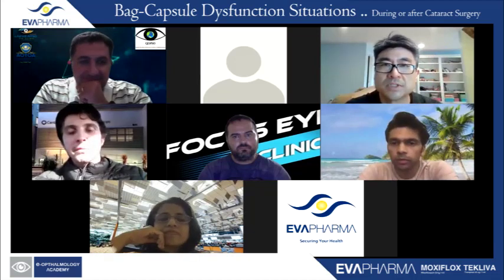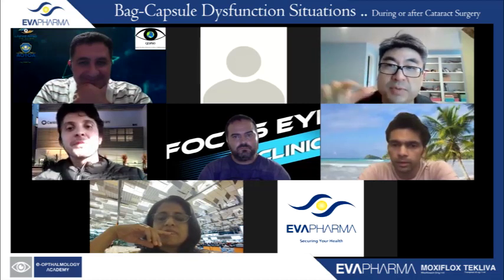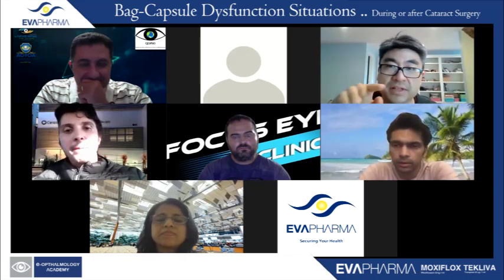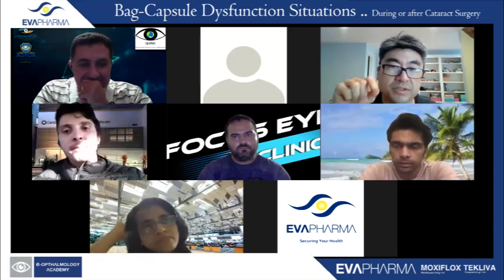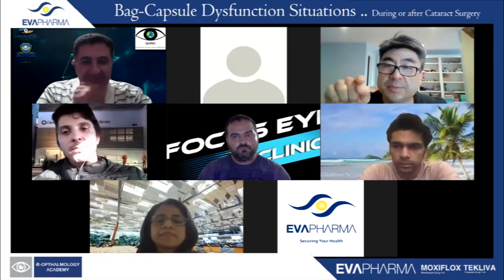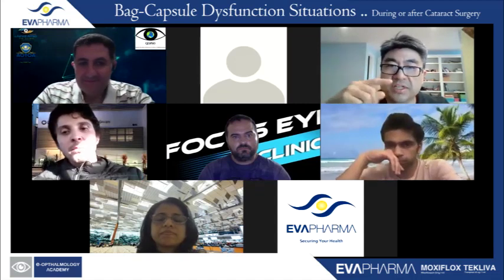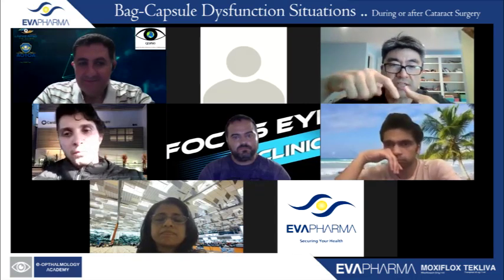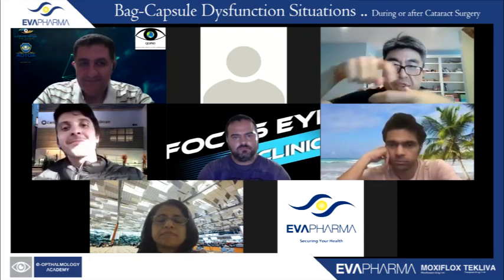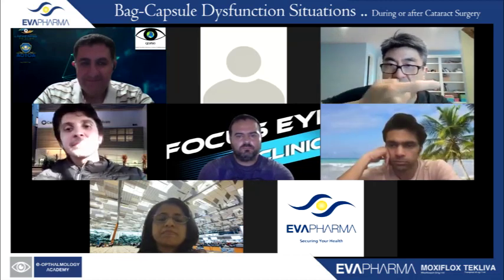Brian, yes, go ahead, Brian. So Sergio, brilliant. You know, we've corresponded before on this technique, and we've talked about making that tunnel. I think it's so important. It's a subtle point, but I think it's so important. So your own CTS segment you developed, I presume, but you could tell me in more detail. You know, the Ahmed CTS segment, the hole is pointing flat with the actual ring, but with your technique, the Prolene needs to come in like this.